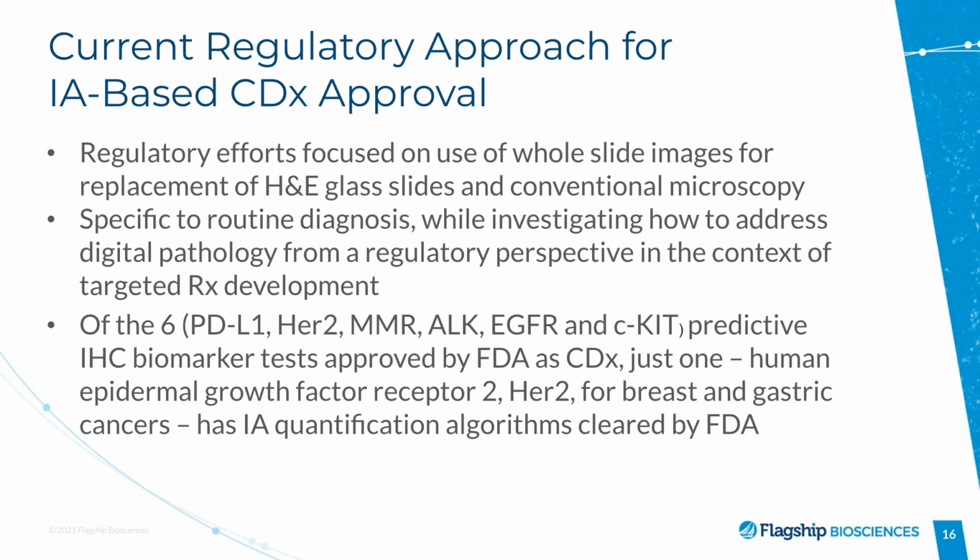For instance, if we are talking as an example about PD-L1, a traditional assay may give you some information on the distribution of the PD-L1 in addition to the quantification. But the digital assay can tell you exactly how many lymphocytes are positive for the marker, how many macrophages are positive for the marker, what level of positivity is in the macrophages in both the tumor and the stromal compartment, the TME compartment.